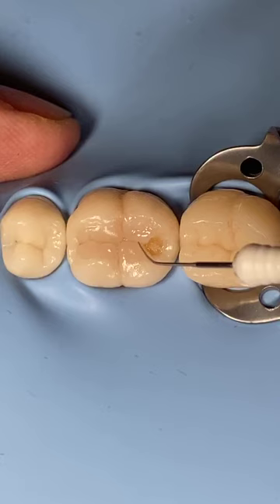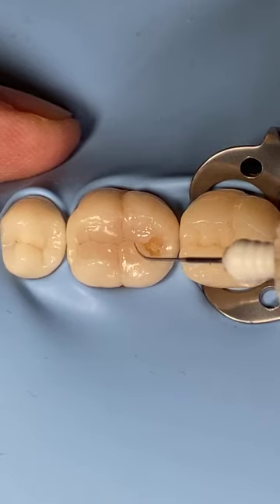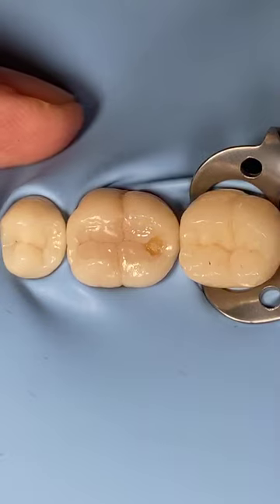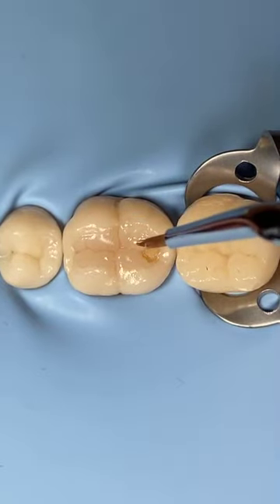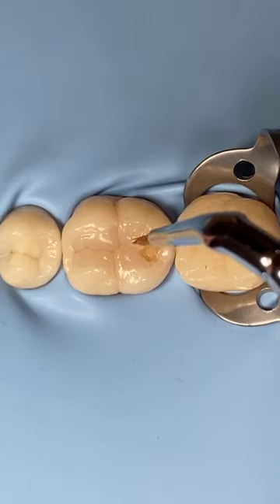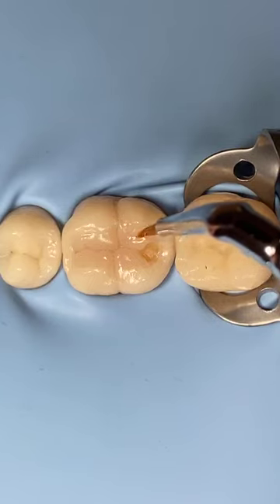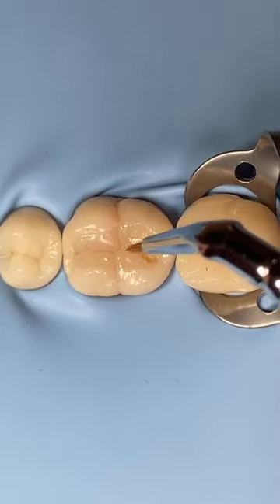Drawing. This is why you have to do the dot technique. If you create a dot technique, it will be so much easier to create a separation. See? And then make it close to each other by using the brush again and again. Only the tip of the brush. This is why I love the Tokuyama brush, because you can use this tip.